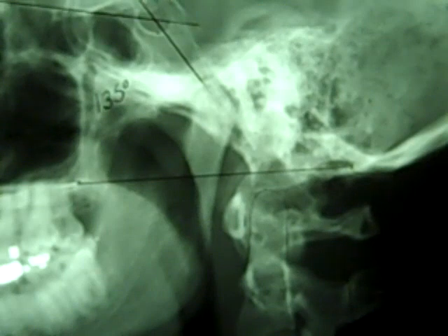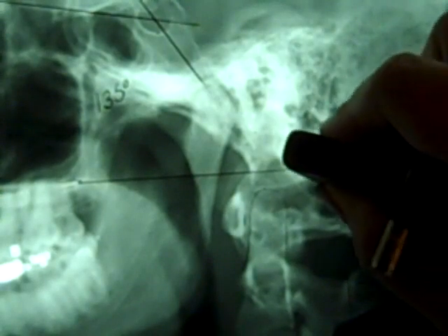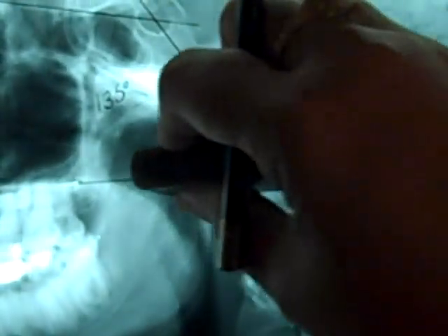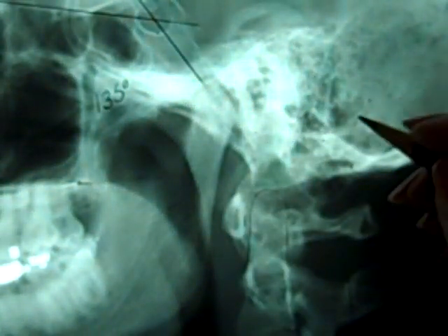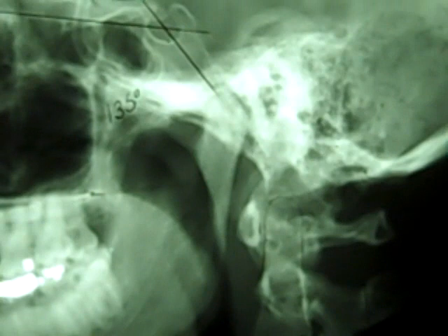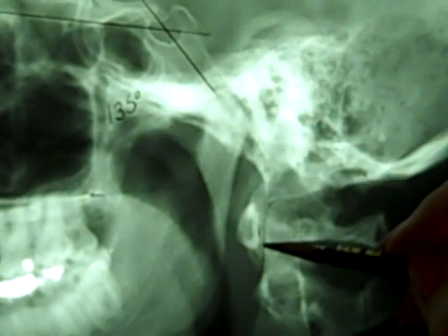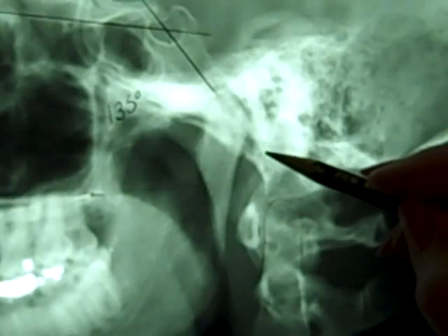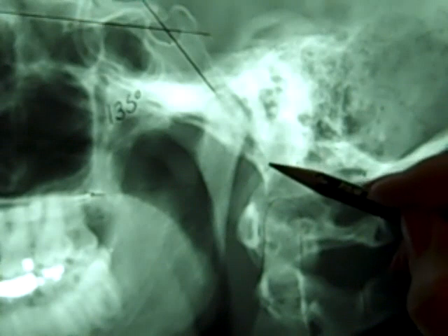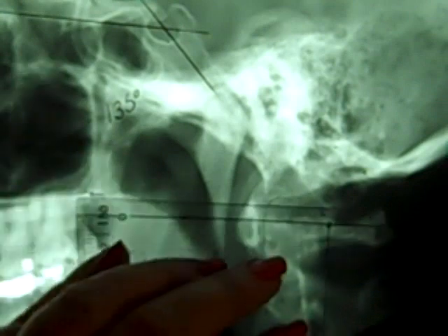And then the last one on this page is called McRae's. And McRae's again, I'm going to take out Chamberlain's a little bit, because having it still in the film might confuse people. So let's just take that out of there. All right, McRae's is going to use the posterior aspect of the foramen magnum and also the anterior portion of the foramen magnum. So again, here's the ADI. Go north. There's that sideways V right there. So the anterior part of the foramen magnum to the posterior part of the foramen magnum, and draw a line.